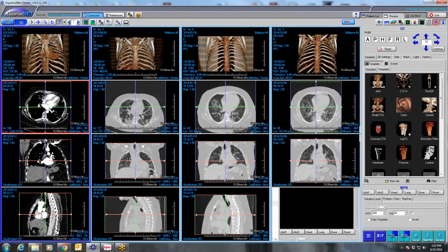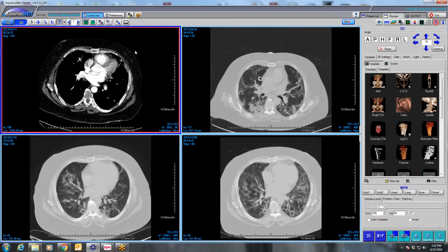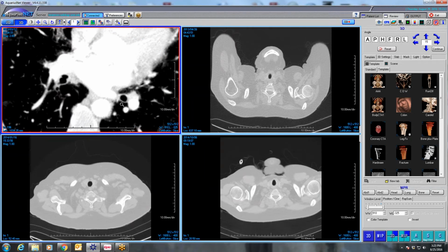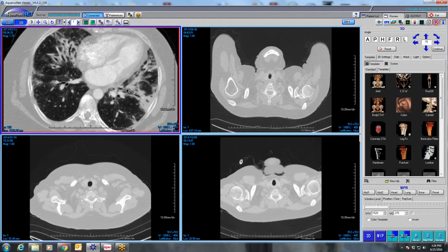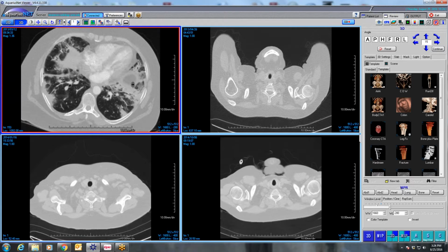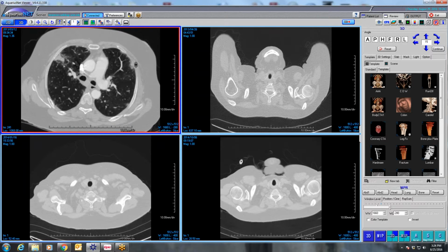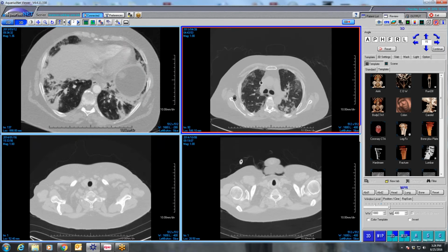So here is a young patient, also with a connective tissue disease. Let me get our dates correct. Here's the first case in 2013. She has a history of rheumatoid arthritis, and we know rheumatoid arthritis is associated with organizing pneumonia as well as usual interstitial pneumonia. But I think anyone would be hard-pressed not to look at this and say it's a gorgeous example of organizing pneumonia, which it was because she underwent biopsy.